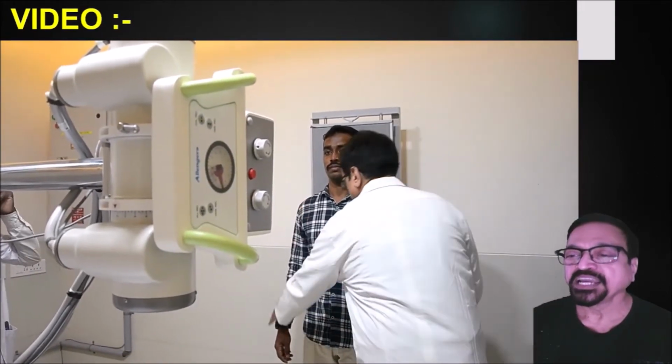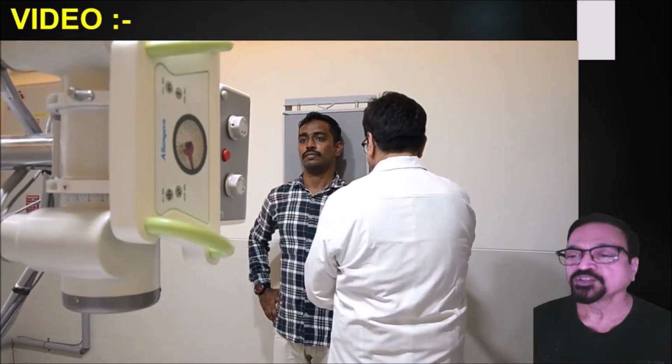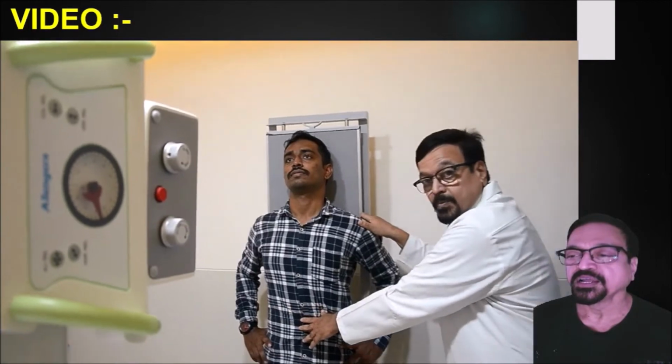The patient should be straight, looking forward, and the central ray should fall perpendicular to the table, or here, the cassette. Now see, the shoulder has to be dropped. The patient has to be pure AP, the neck should not be tilted, and the chin is elevated a little bit to get visualization of C1, C2. Now everything is checked and we can go for an exposure.